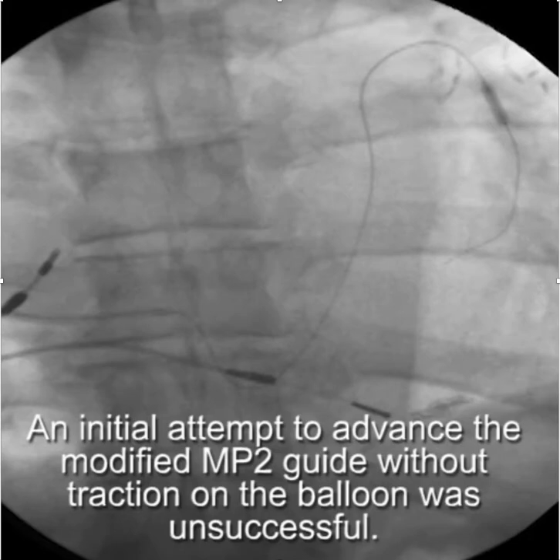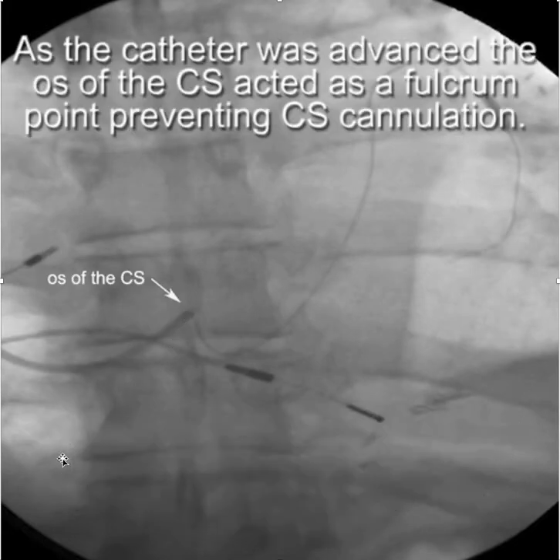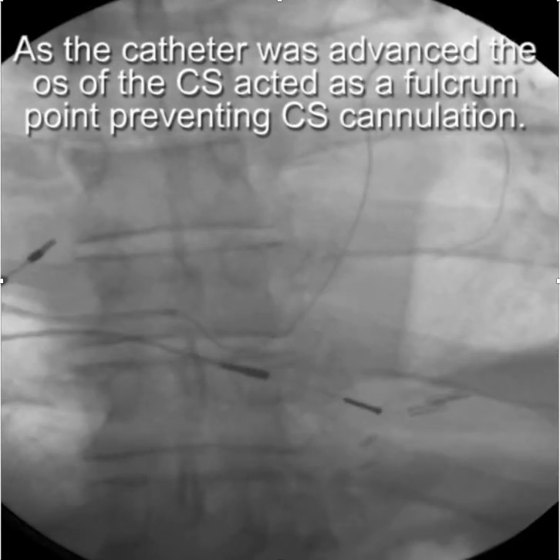My initial attempt to advance the multi-purpose guide was without traction, and you'll see that as I advanced it, the CS os created a fulcrum point and the back end of the guide just dropped — I was not able to cannulate the CS.